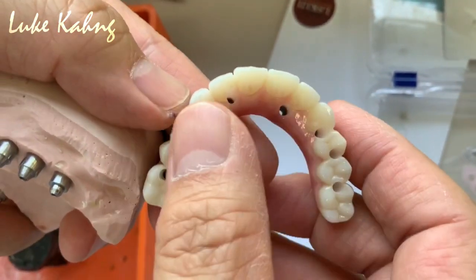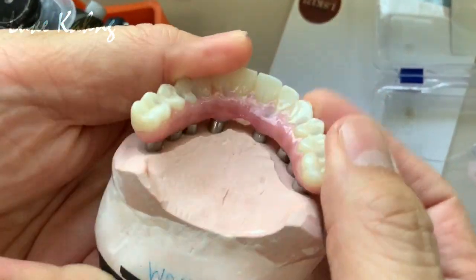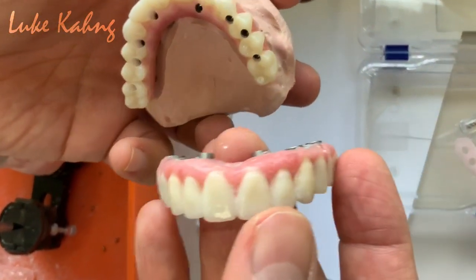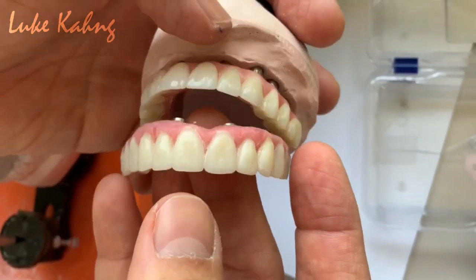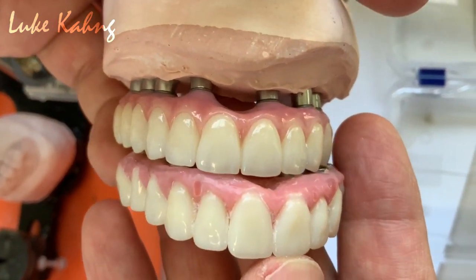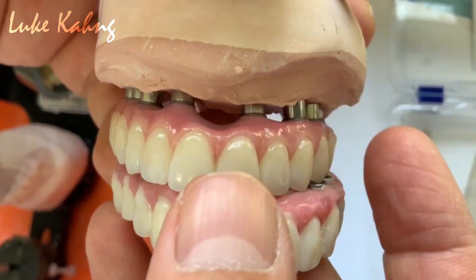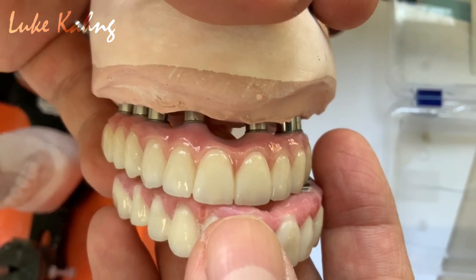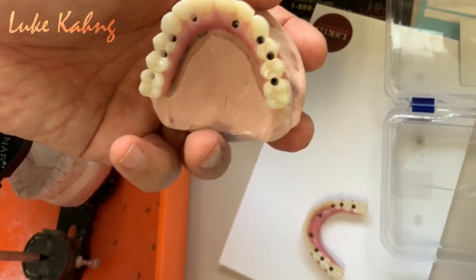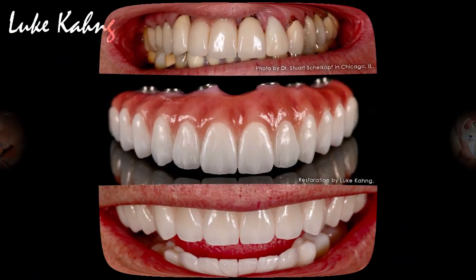Okay, here's occlusion is monolithic. Yes, let's make sure the whole tie base is down. Doctor gave us a pretty good format. Try it. Okay, this is more lifelike restoration, especially this gum. Emphasize it. Individual looking. And then also give them the stent. It's great.